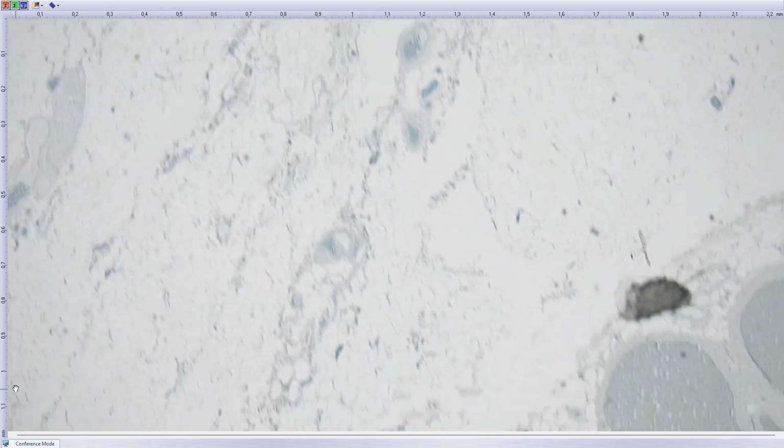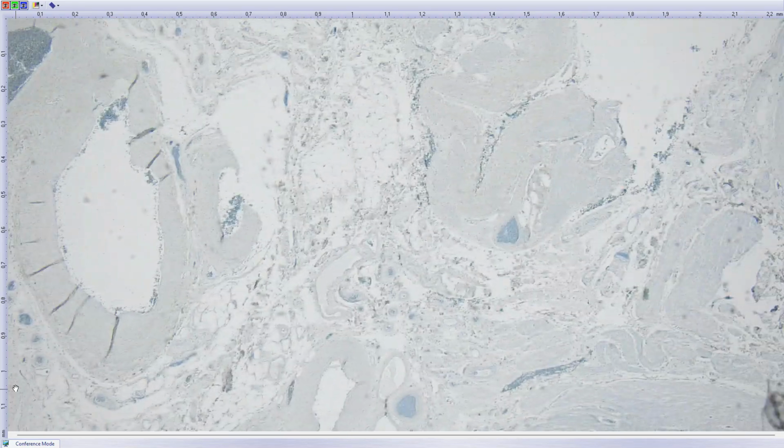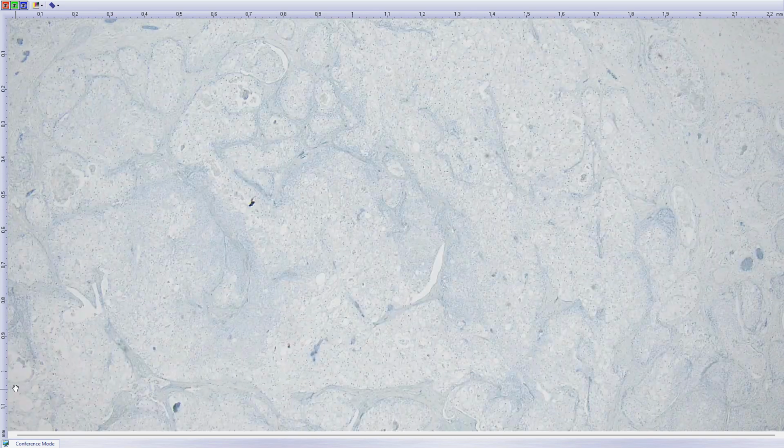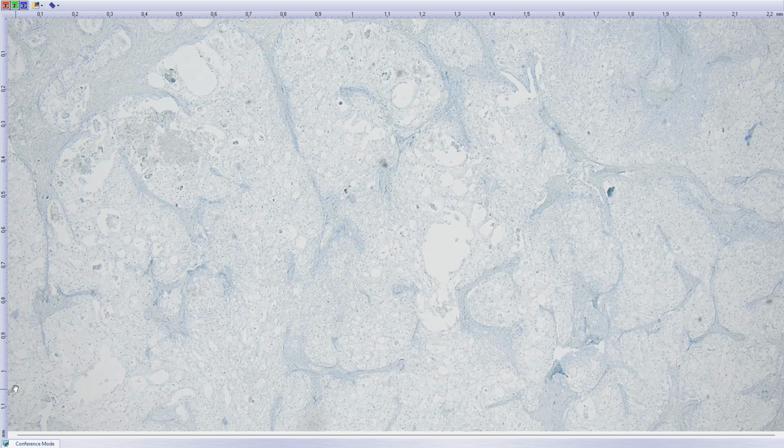This was my case and Michal's case a few years ago. So we had a discussion with clinicians and pathologists who sent us this case, and they told us this patient has prostate carcinoma few years ago, so there is a high probability this will be prostate carcinoma as well.